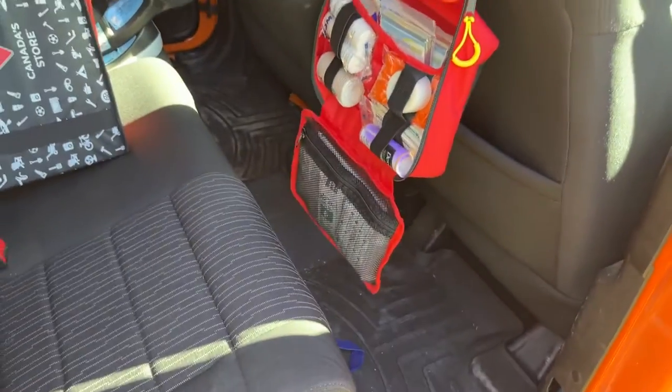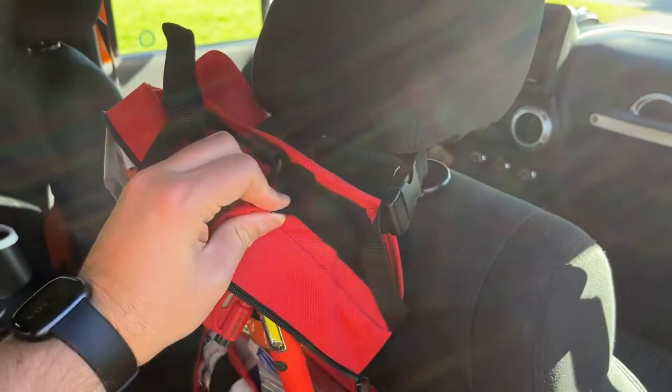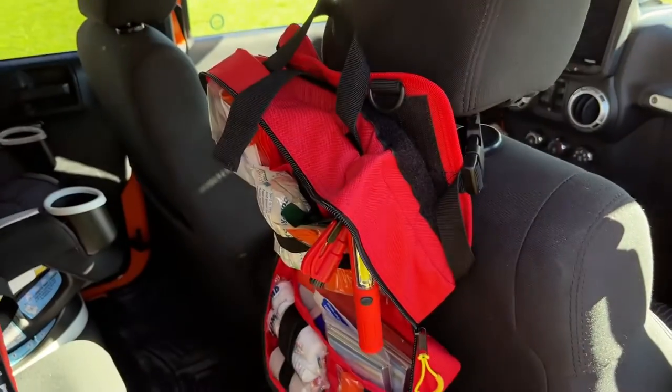The whole kit can stay mounted here, so it's usable right on site, which is nice. Or you can pull the entire piece off the velcro backing to take the kit with you.